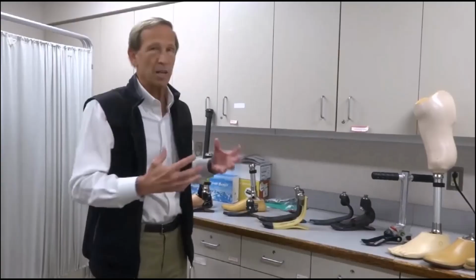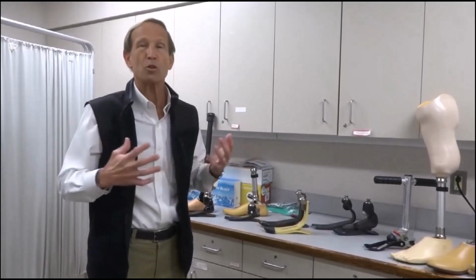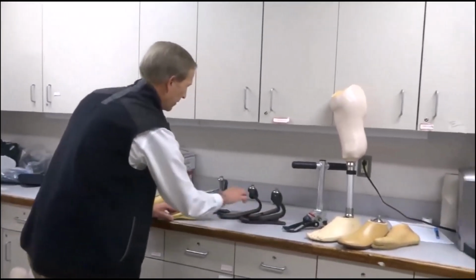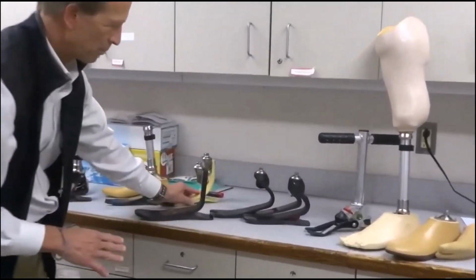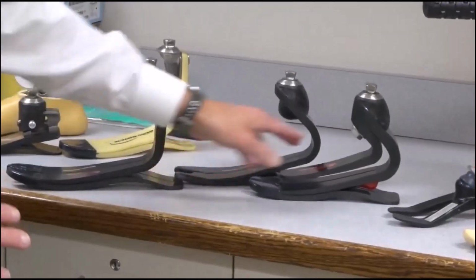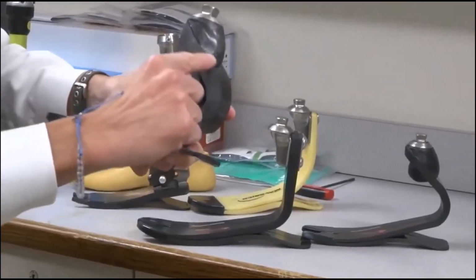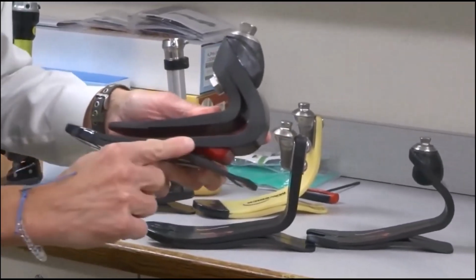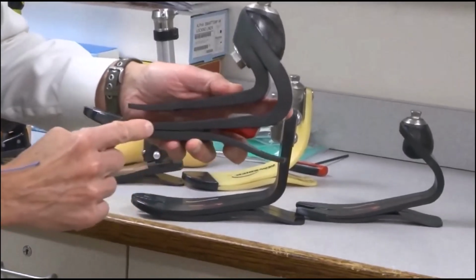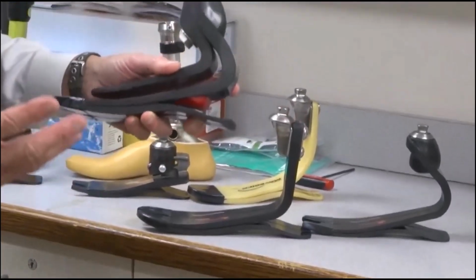There are lots of different companies that make them, and each company makes a variety of designs. There's almost too many choices. You can see even from these 3 that are here, they're all carbon fiber, but they're set up a little bit differently. Sometimes they zigzag the carbon fiber. Sometimes they put multiple layers of carbon fiber, because for everyday walking you might use this sort of bottom portion, and if you try to run and jump, then the bottom portion bends a little bit and you start using the second piece.